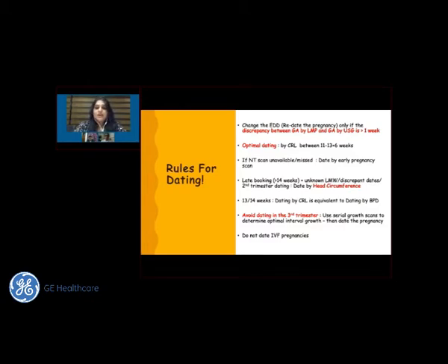Okay. Now, in case she comes late, she presents to you for the first time at 16 weeks. She does not know her last period date. Suppose she conceived in lactational amenorrhea or she has PCOS. She doesn't know her LMP. Or if the dates are discrepant, the best way to date the pregnancy after 14 weeks is by head circumference.